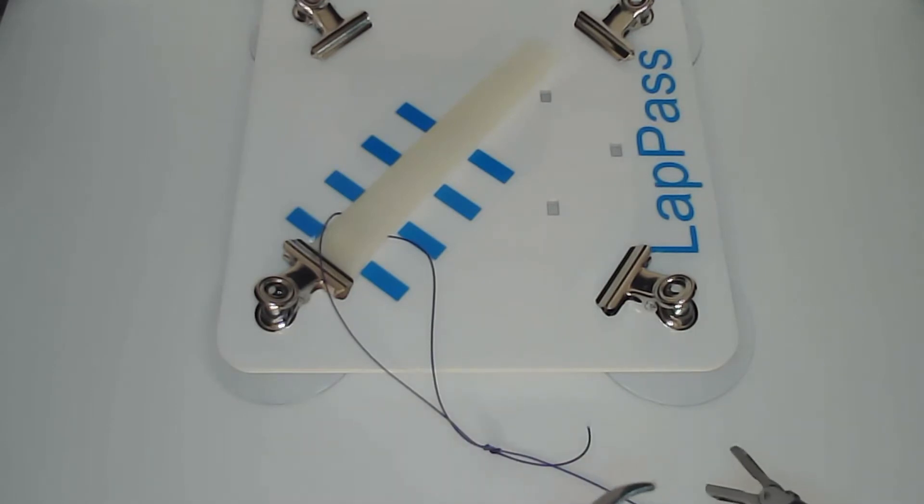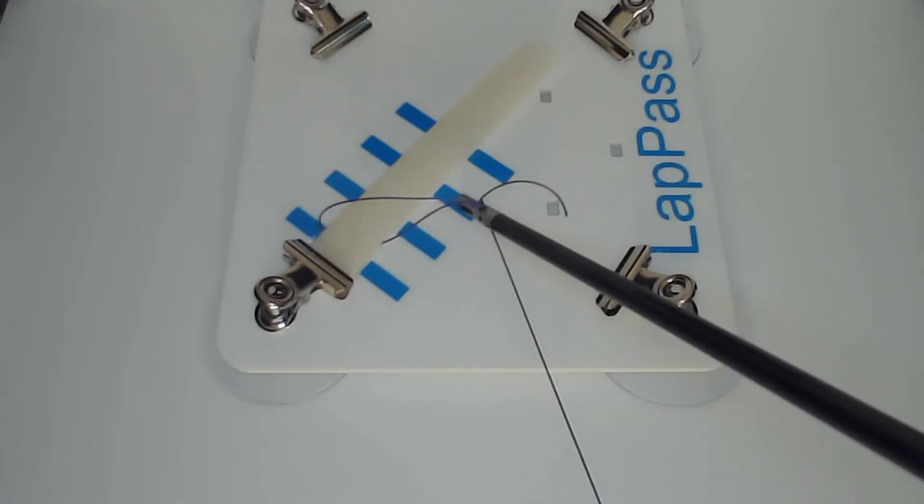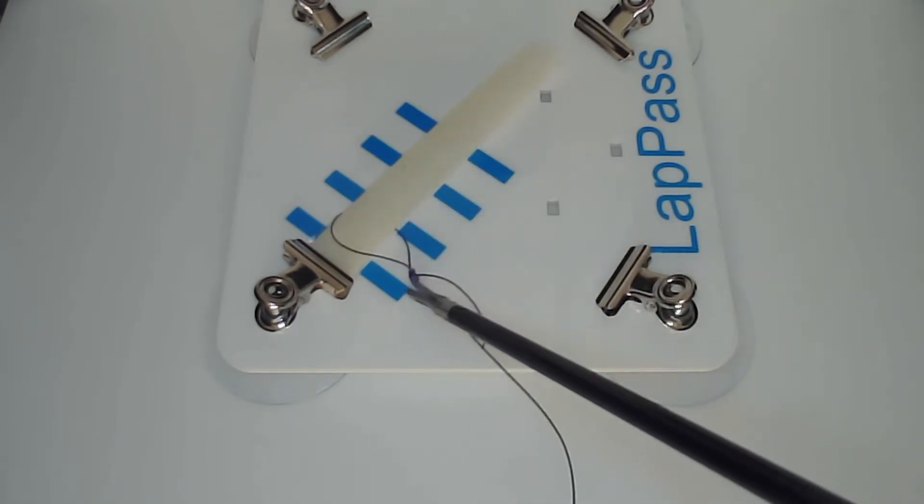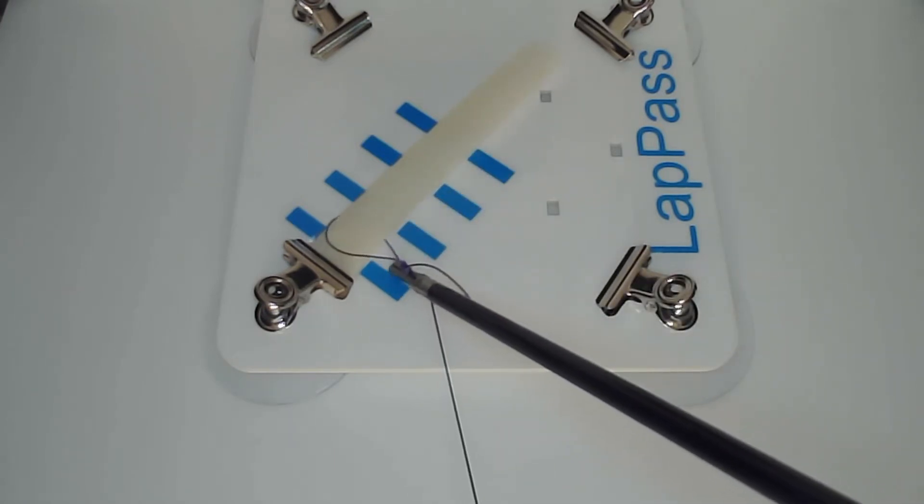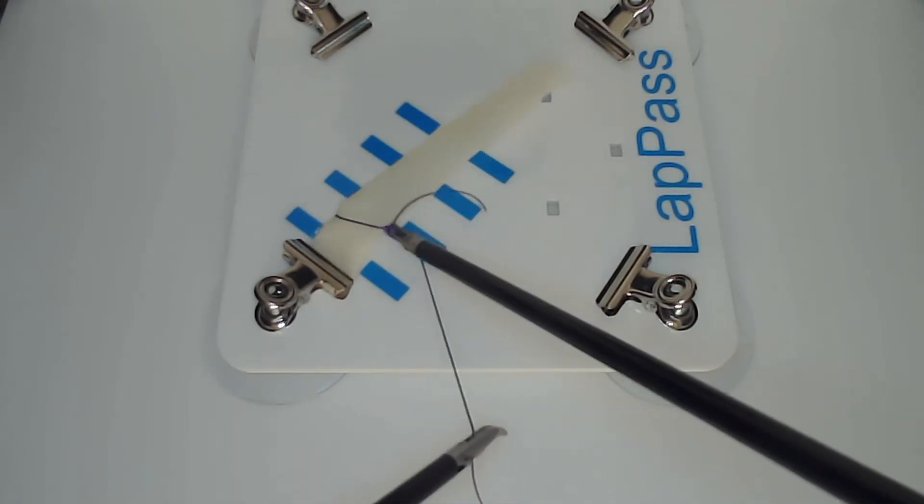The first knot is formed in front of the examiner outside of the eight minute slot, and this gives time for you to show the examiner that you know how to form the knot properly. The next two knots you have to form within the eight minute time frame.